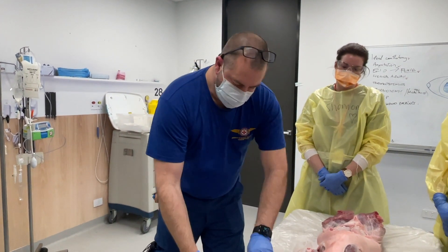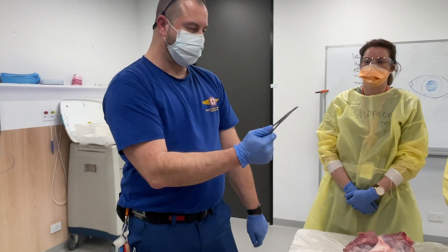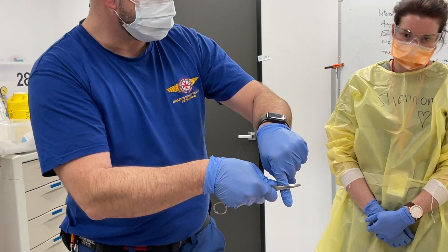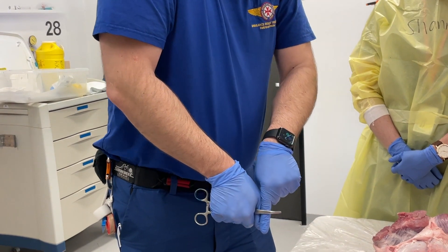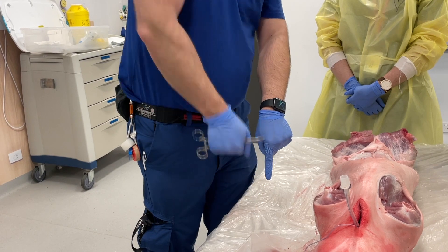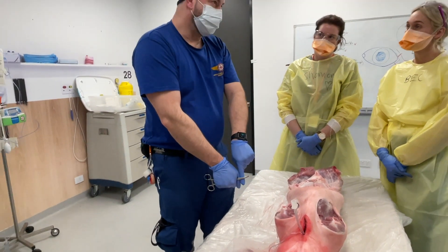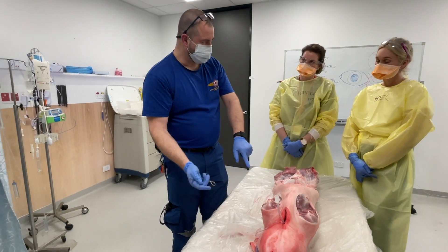With your forceps, and this is really, really important, in an anti-plunge grip, so that you're not going to inadvertently go all the way into the thorax. You're going to hold your forceps, go over the superior margin of the rib, pop into the thorax, and then get into the thorax itself properly. Then you're going to blunt dissect the muscle off. Often the first stroke is mechanically advantaged to go down and then go up, doing this supine on a stretcher. It often takes a few throws to blunt dissect that muscle off and then you're done. That track will be maintained. Put your finger in, do your finger sweep, and it should be lung up and then move on.